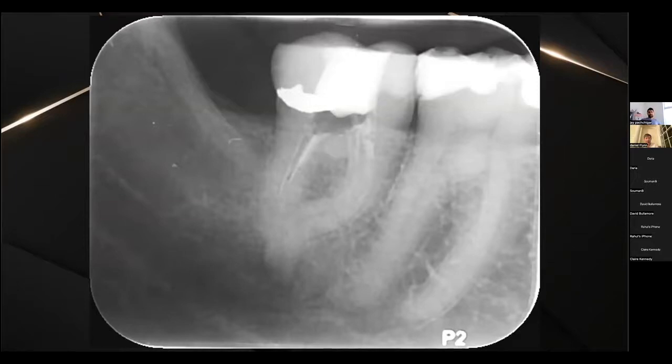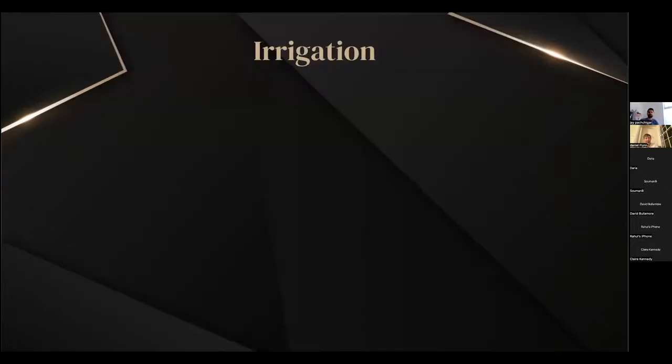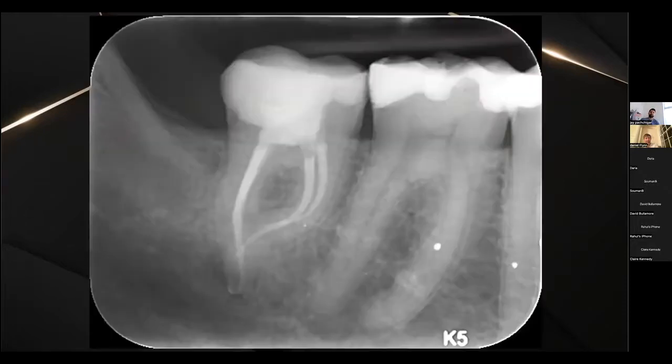And again, this was, I think, the one that I have posted. On that quite S-curve, you're really not going to get your plugger anywhere near the apex on those mesials, and for me, the only way to obturate these is the bioceramic materials. You're not going to be getting any sealer to the apex on these types of cases. With these types of cases, anything a little bit skinnier, your irrigation becomes very, very important.